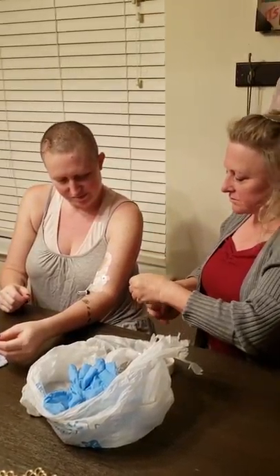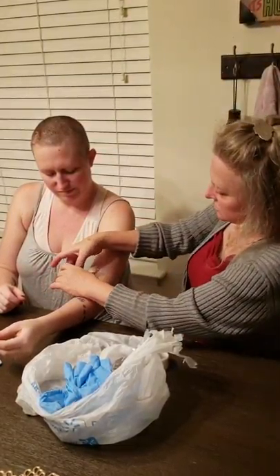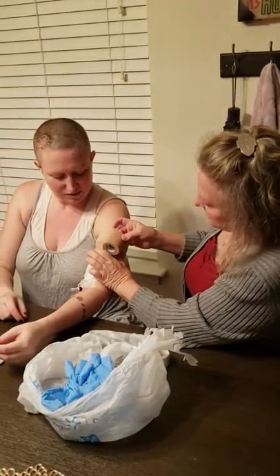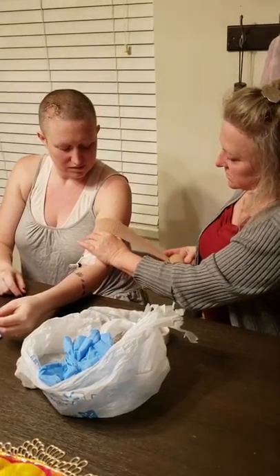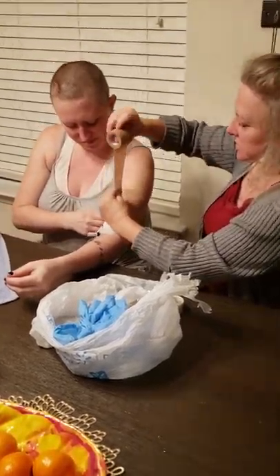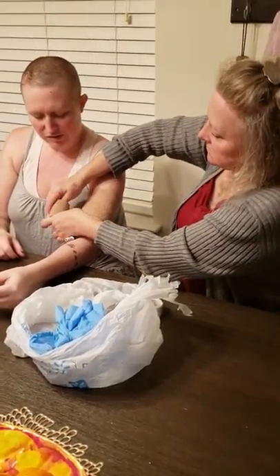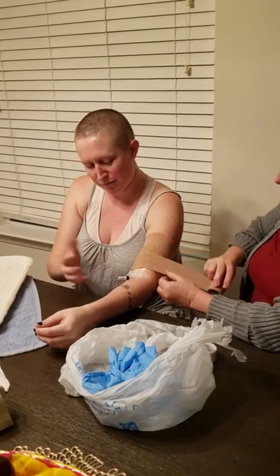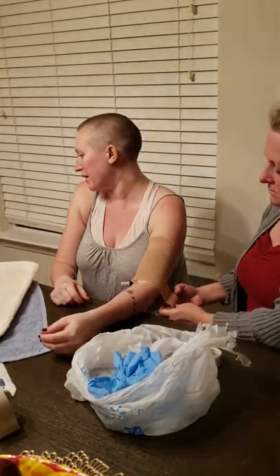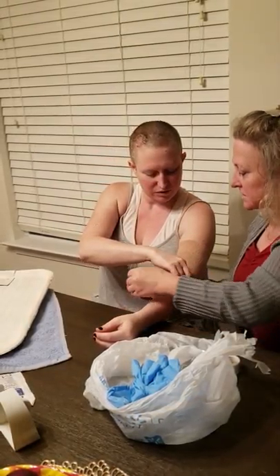This is Coban or CoFlex — it sticks to itself. She locks it all the way up to the top and then all the way back down, because she's been using ice packs, and she showers. It's just an extra barrier between the dressing and the tubing. The only part that has to be covered up is that part. I need to buy you some more of that — it looks like you're running low. It's going to run out. Is this the second row already?